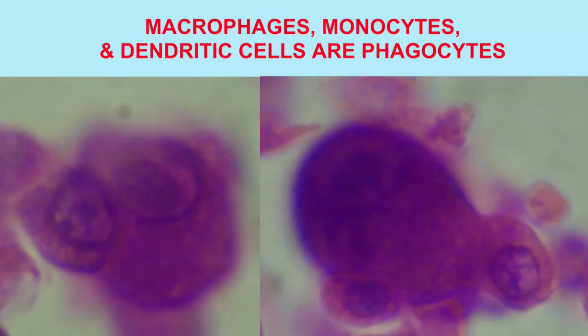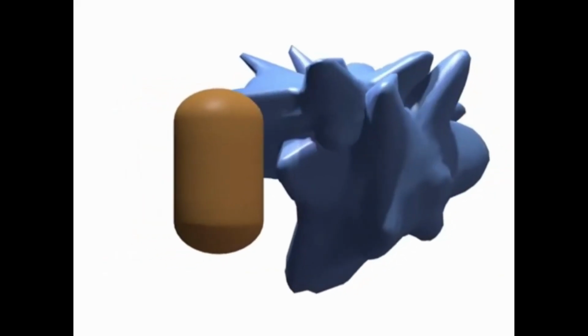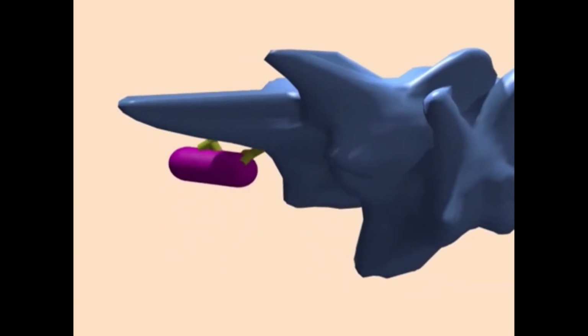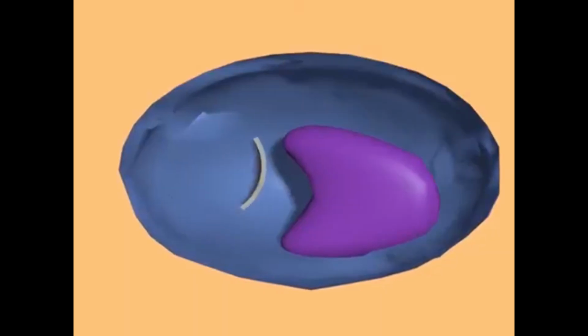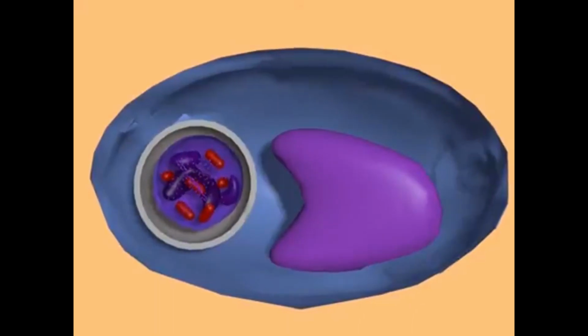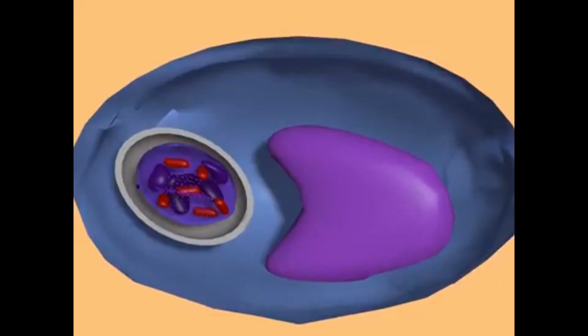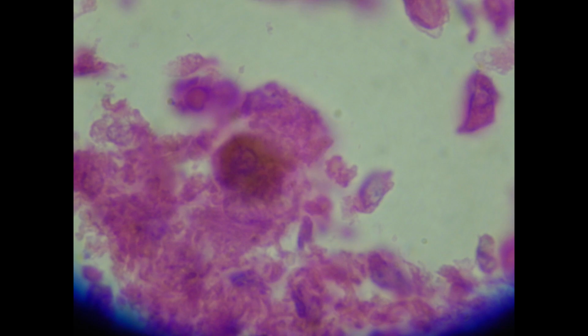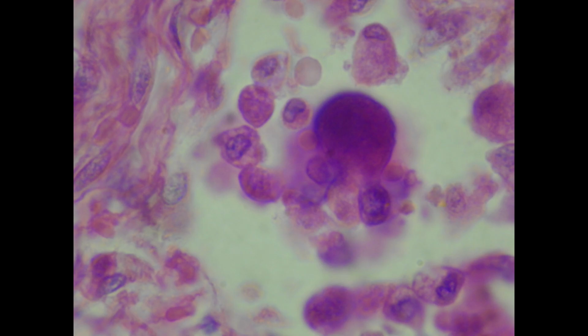In general, these cells are performing two types of functions. They are phagocytes. They can perform phagocytosis and ingest other cells. This could be bacteria and other microbes. This could be larger infectious agents, even yeast, which are large cells. But they can also ingest large cells such as an infected cell, or a neutrophil, which has ingested bacteria on its own. And they can also ingest some of the debris which might result from infection and dying cells.